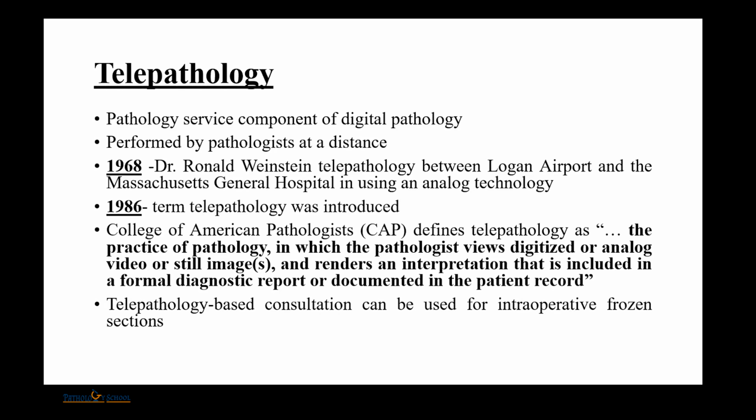He started it between a clinic in Logan Airport and his hospitals. He also coined the term telepathology, and in some institutes is also regarded as the father of telepathology. So what does CAP define telepathology as? It says it is a practice of pathology in which the pathologist views all digitalized slides and gives an interpretation on those, and they include it in their formal diagnostic report.